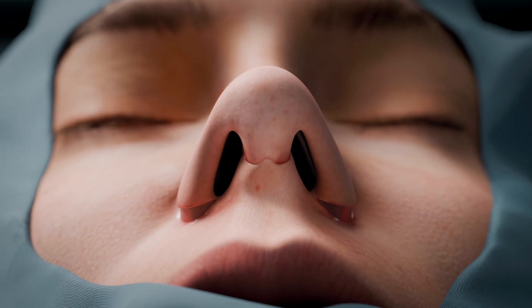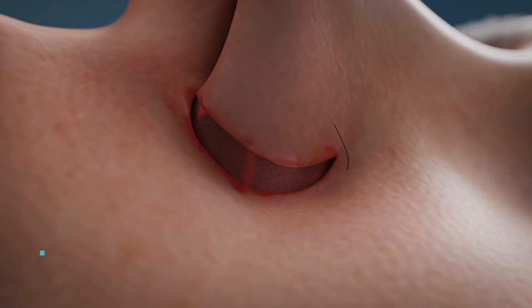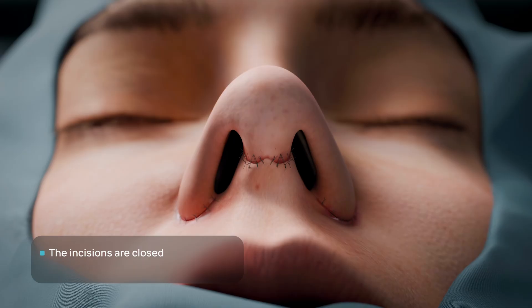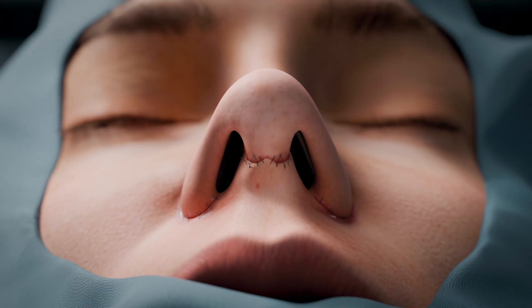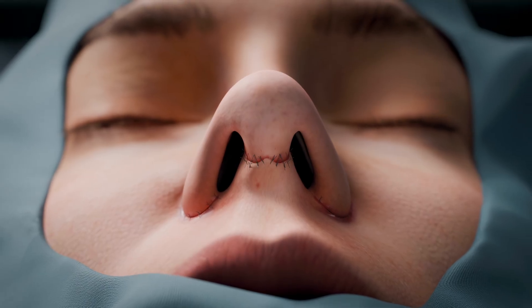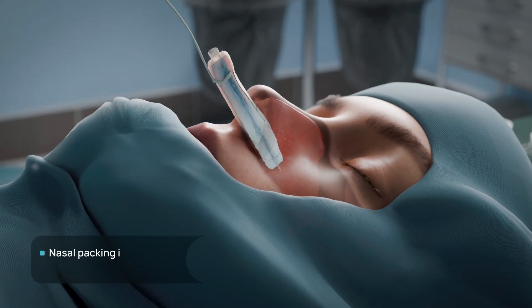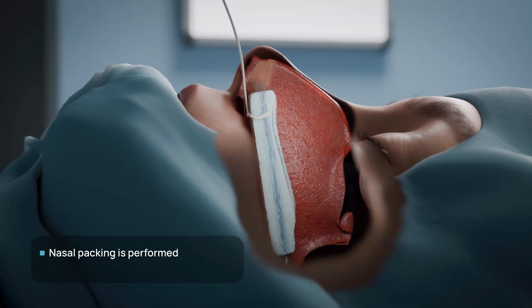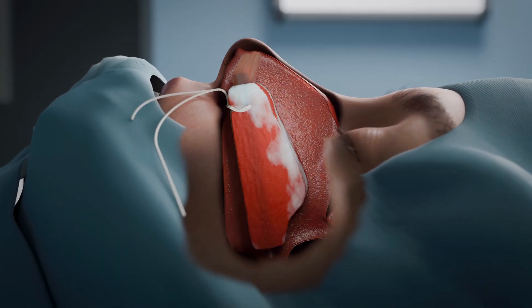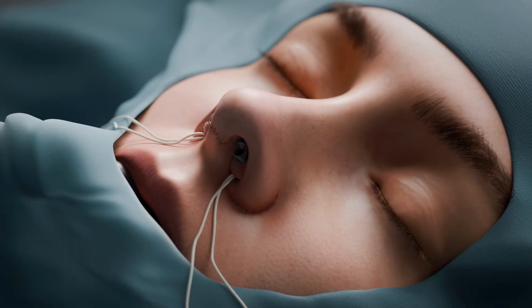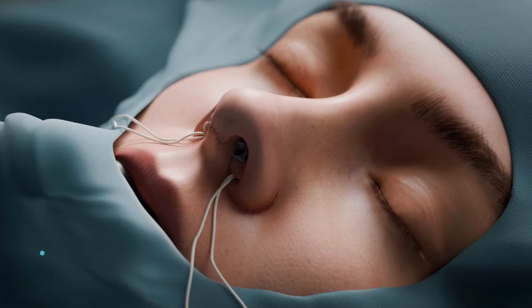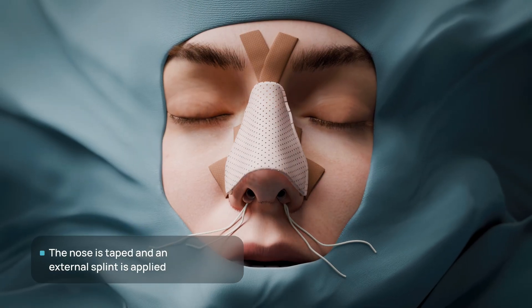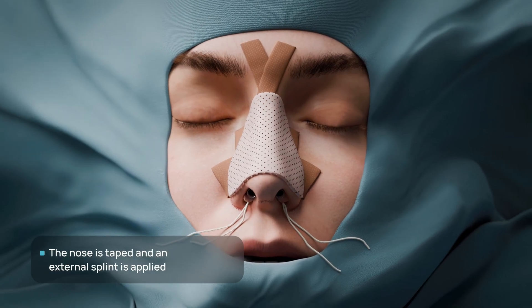All incisions are closed with fine atraumatic sutures. Intranasal sponge tampons are inserted to stabilize the septum and prevent postoperative bleeding. Externally, the nose is taped and a plaster cast is applied to immobilize the nasal bones and preserve the surgical outcome.